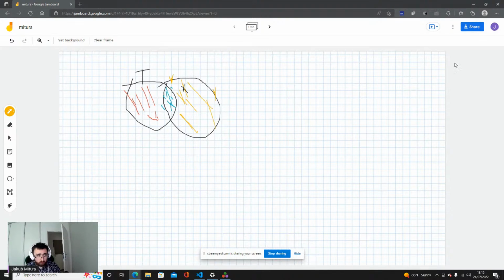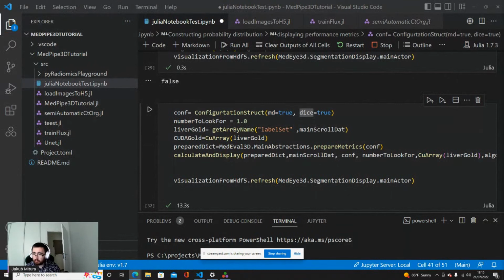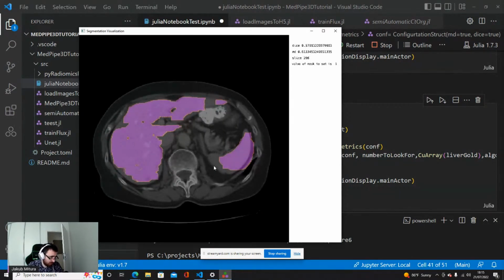So when we are looking back at the image, the Mahalanobis distance is not completely a metric, so it's not normalized, at least not in this case, to the range between 0 and 1. But here you can get the idea that if you did it a lot of times and compared between different cases, the Mahalanobis distance will give an additional penalty to all voxels that are distant from the true image.